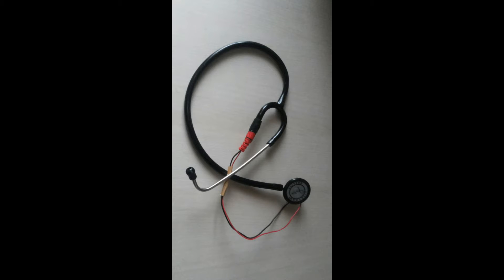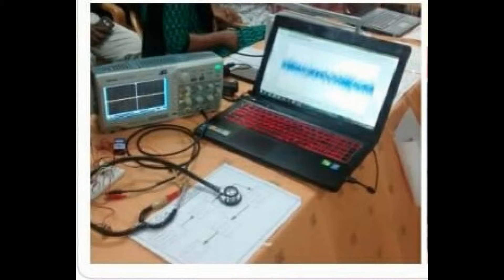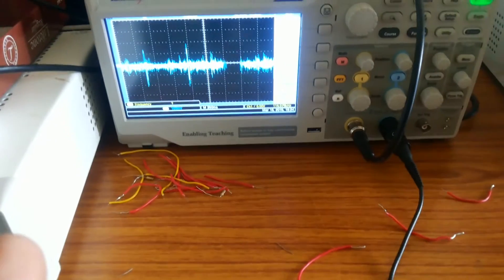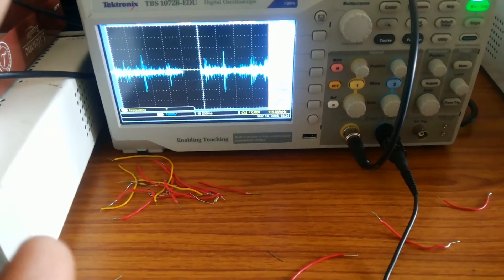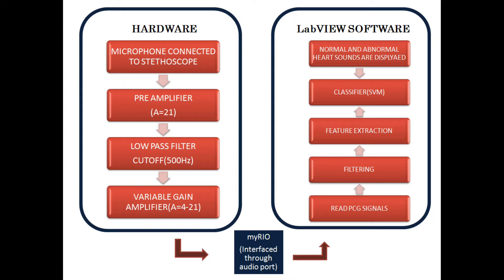Hi friends, we are developing an intelligent stethoscope based on LabVIEW that acts as a stand-alone diagnostic system. In this video, we have displayed the heart sound signals obtained from a hardware setup.